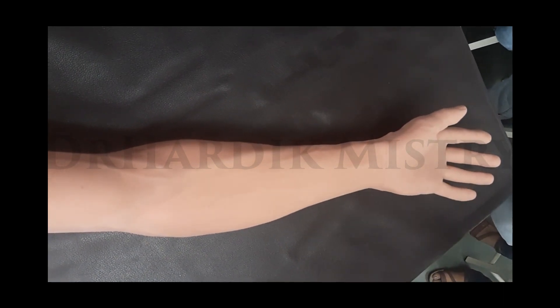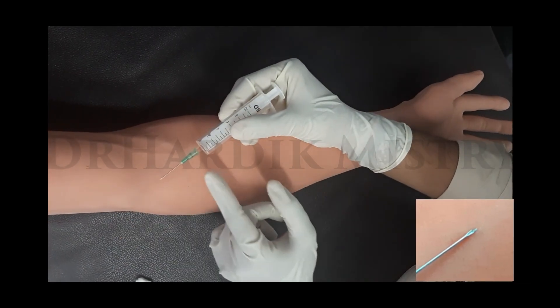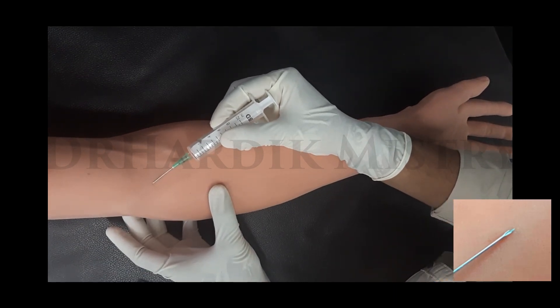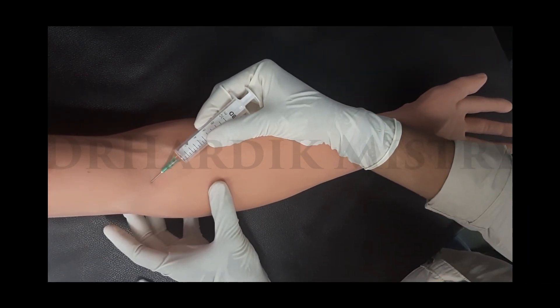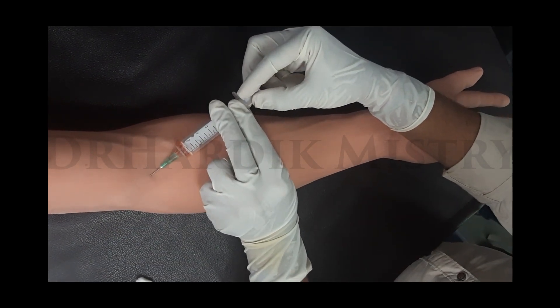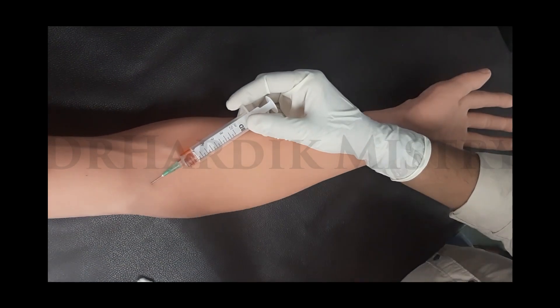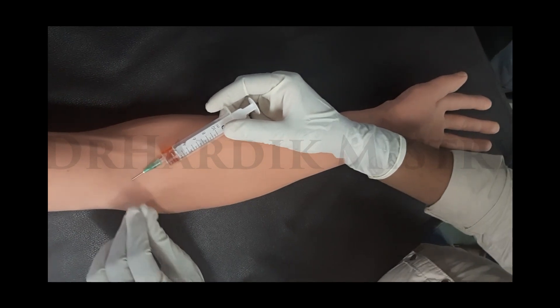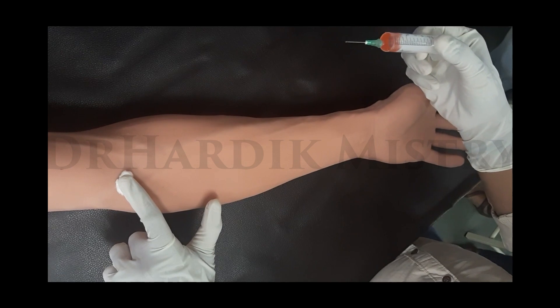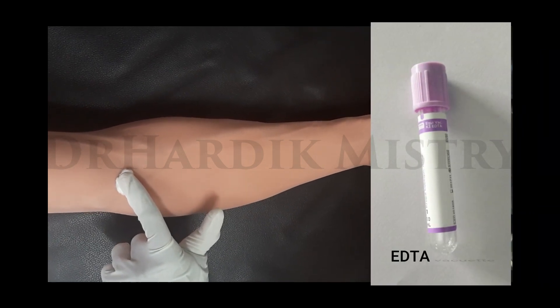For example, this is the vein and we have to insert this pointed end of the needle inside the anticubital vein just like this. Once we insert it, try to lift the plunger so that the blood will be coming out. For example, if we need to take 2 ml of blood — once the 2 ml of blood is collected, just try to block this puncture site and remove the needle, then drain it inside the anticoagulant container.